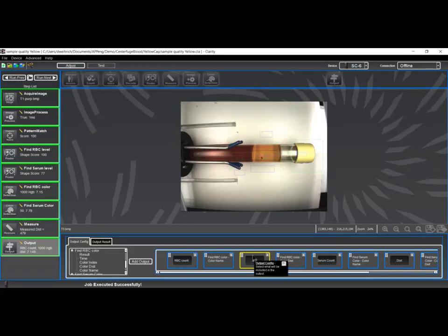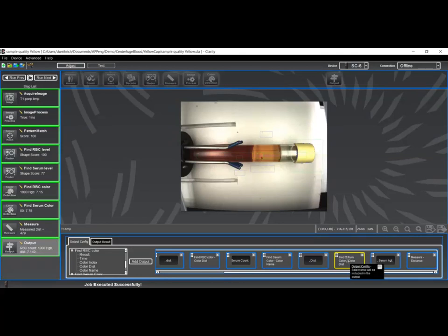So that's what comes out as a number. Then close that field off at the period, and then I'm also outputting that color distance from the same step as, again, a kind of a confidence level of how close of a color match I was to the reference table. I build this up with the serum count, same thing. It's basically the color name for the different guide values that were in that reference table, and a confidence level based on the color distance from the algorithm output. And then finally, I'm giving you the measurement for the serum height. That's the difference between the two different liquid levels that were found in previous steps.